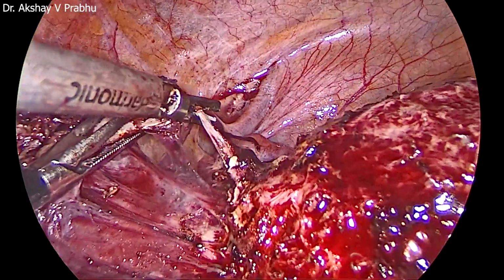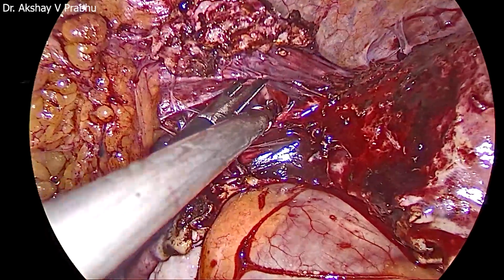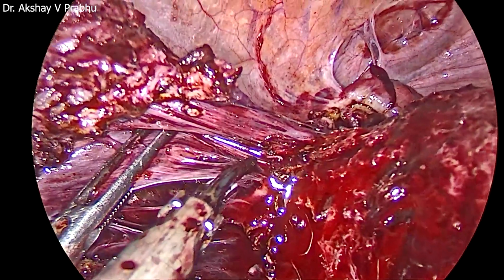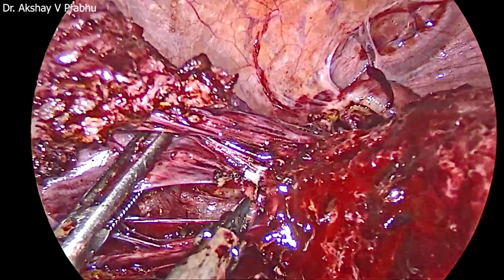So that is a scar tissue area which has been completely released now. The bladder is not completely gone. Bladder fibers are still there. So now I am directly going into these superficial bladder fibers or the UV fold fibers which are still adherent to the previous scar.